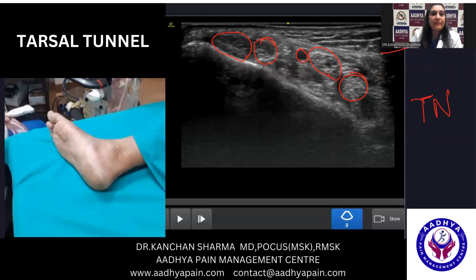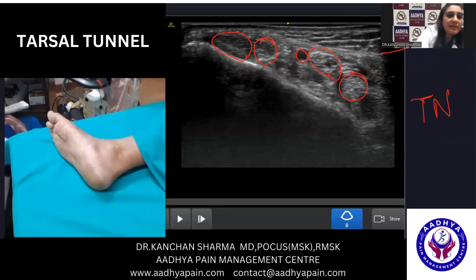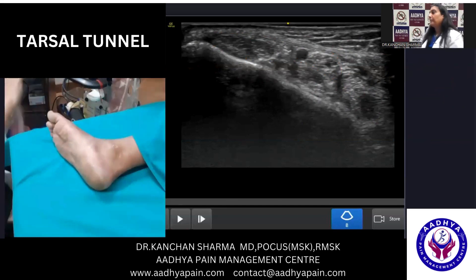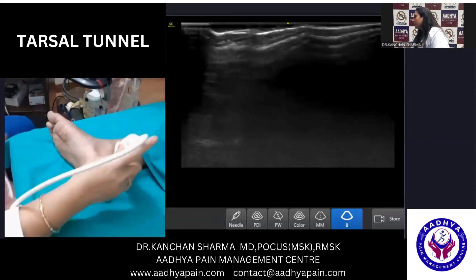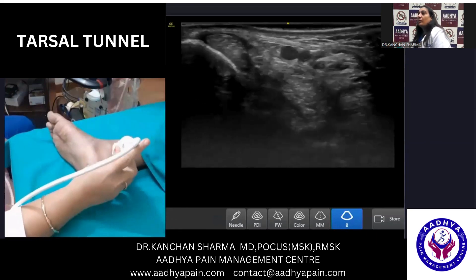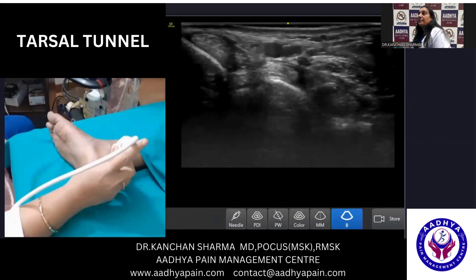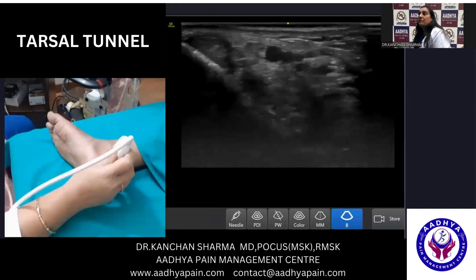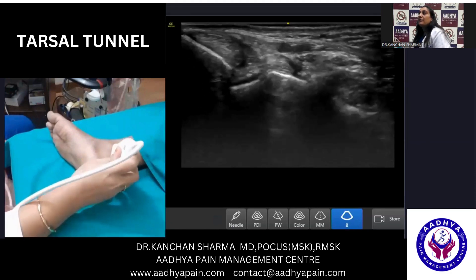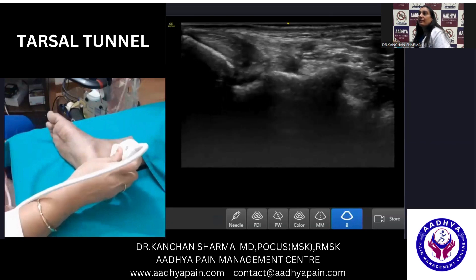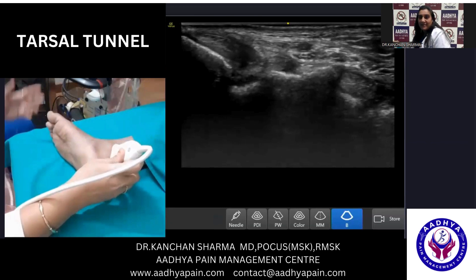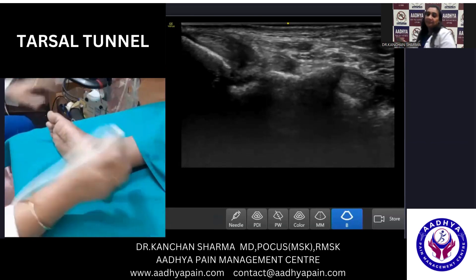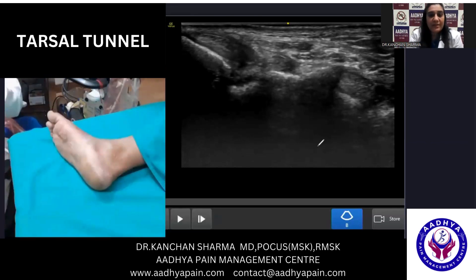Now I have just released the compression and you can see the veins. I will apply the compression again and you will see that the veins have collapsed while the artery stays the same. That finishes the demonstration of the tarsal tunnel.